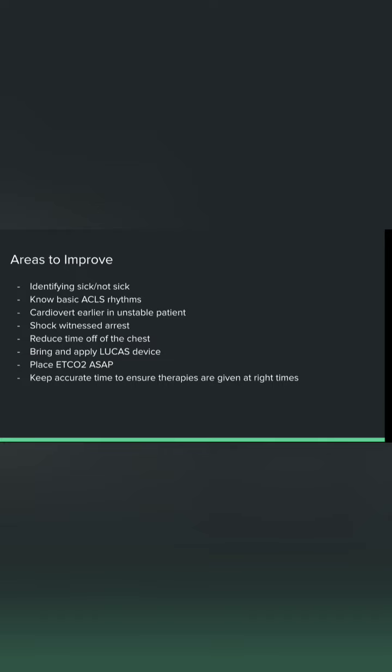as an unstable patient who just had a sudden decline in mentation and pretty suggestive of a cardiac event, I think that it would be most appropriate to just go ahead and proceed with that cardioversion, not worrying about things like sedation or analgesics prior to that, but to just do that as an emergency procedure.